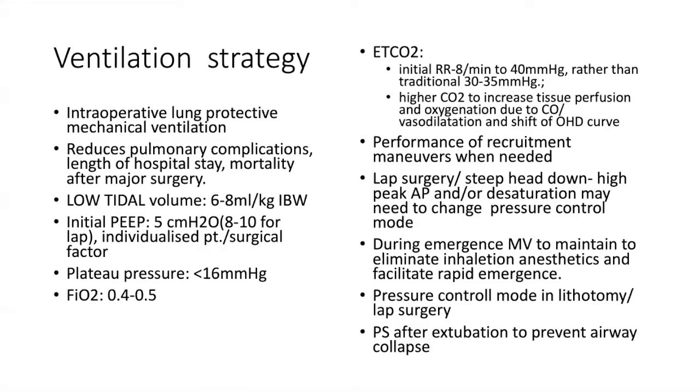During emergence, even with mechanical ventilation, minute ventilation is to be maintained to eliminate inhalation anesthetics and facilitate rapid emergence. If minute ventilation is not maintained, it will take time for the residual anesthetic gases to come out. Pressure control mode in lithotomy and lap surgery. Pressure support after extubation to prevent airway collapse.